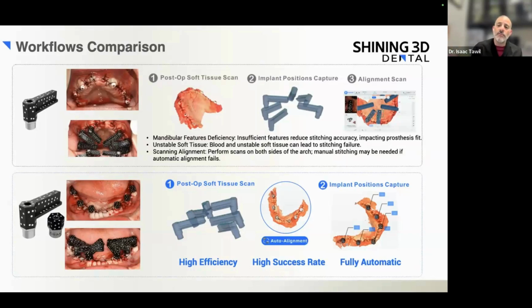I take that initial scan with the fiducial marker. I take my bite, my occlusion. I take my opposing, and my bite, my occlusion. I then go ahead, extract everything, put my implants in, and I have my photogrammetry captured. And then I use these CAP scan bodies that will align the data together, which I'll show you in a moment. So let's take you through that real quickly.